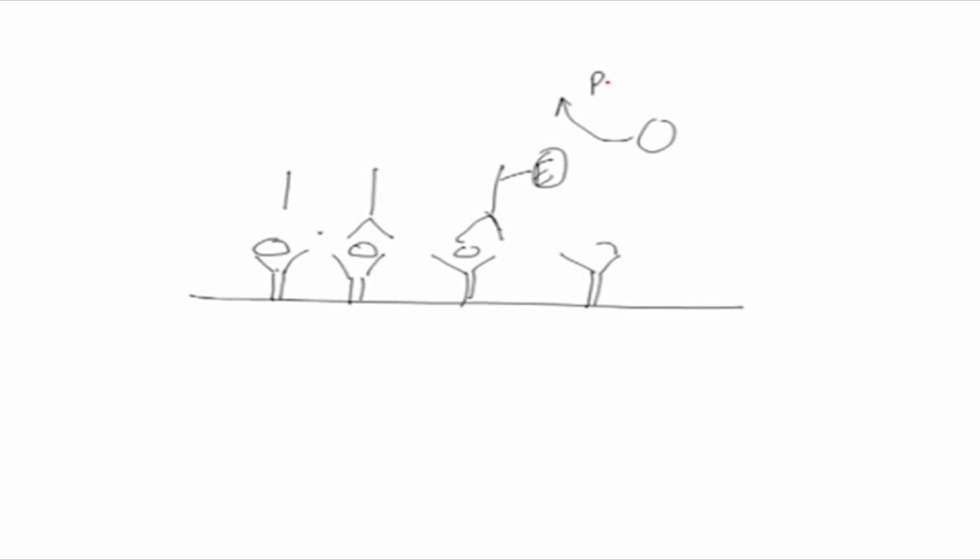So, it is called sandwich ELISA because this antigen or analyte is sandwiched between the two antibodies.